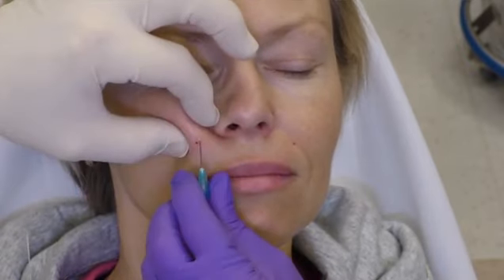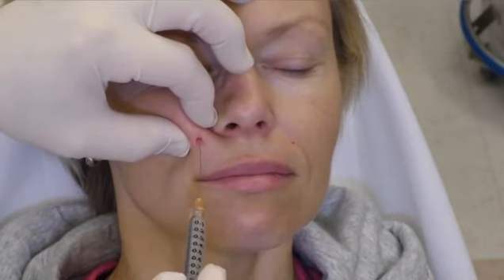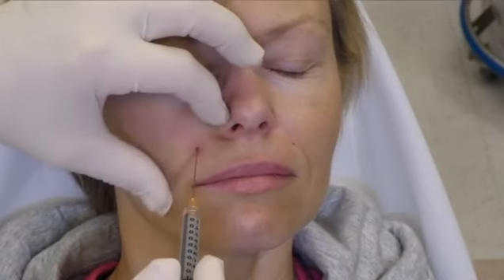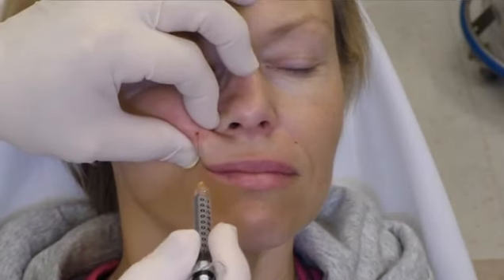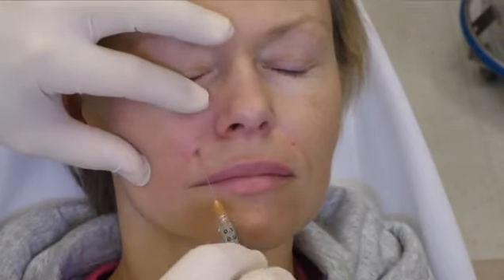An introducer is placed roughly 1 to 1.5 centimeters lateral to the alar base in the nasolabial crease. The levator labii superioris and sometimes the zygomaticus minor run close to this area. Because of that, oftentimes a deeper approach with the cannula is more efficient in time usage, gaining access to the tear trough through the peripiriform space rather than the premaxillary space.